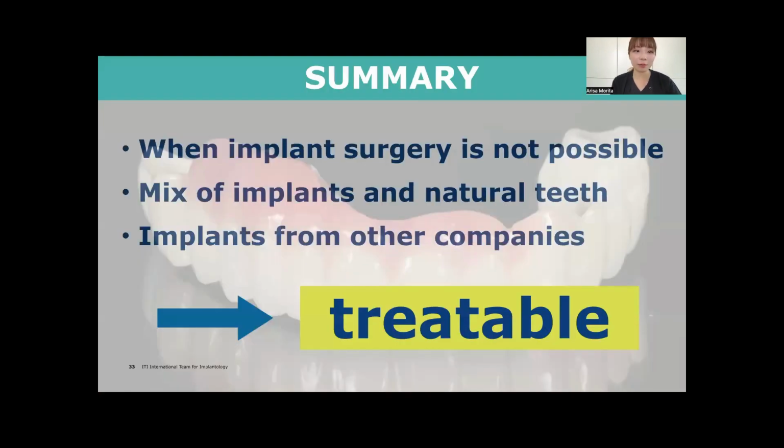This is a summary. When implant surgery is not possible, or in cases with a mix of implants and natural teeth, or implants from other companies, even in such cases, treatment is possible with a PEEK bridge.